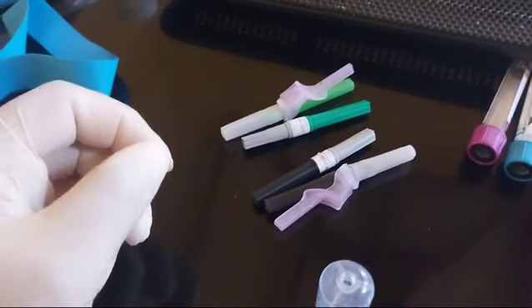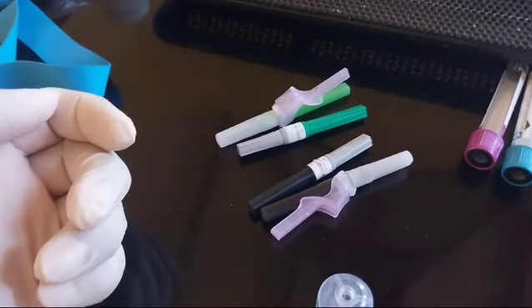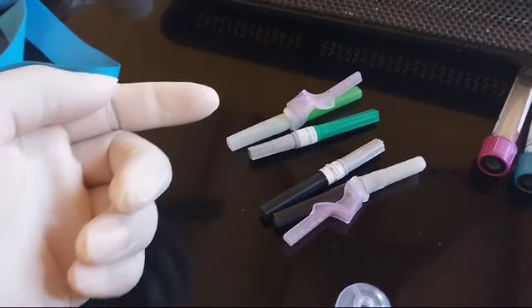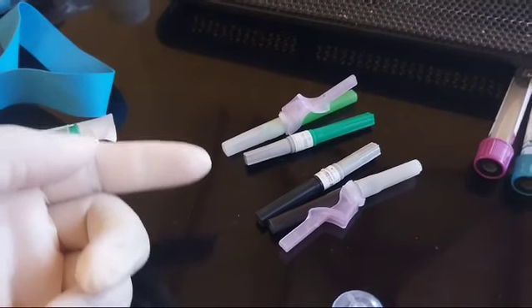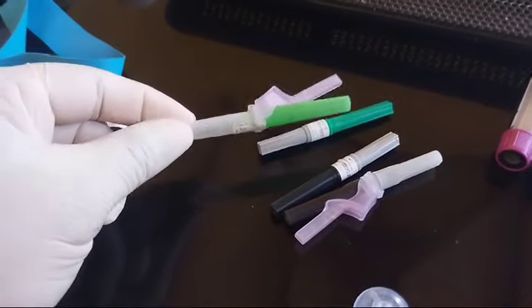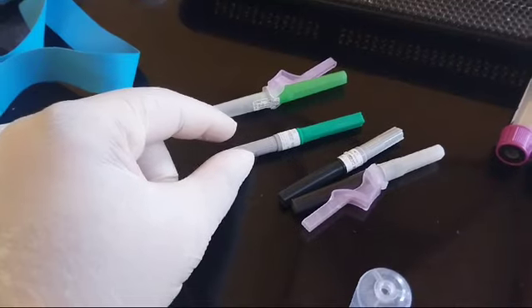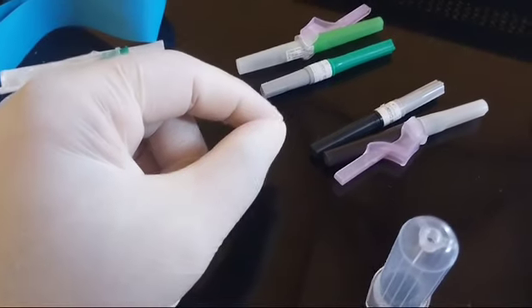I wanted to talk about the evacuated needles we use to draw blood. I have with me a green one and a black one. The green one is a 21 gauge and the black one is a 22 gauge. They are two different types, different brands. This one has a safety mechanism and this one doesn't.